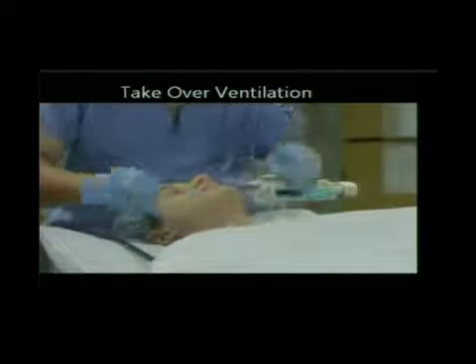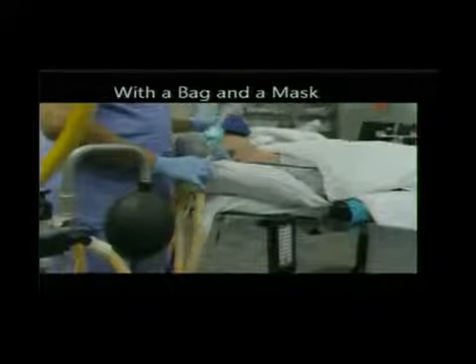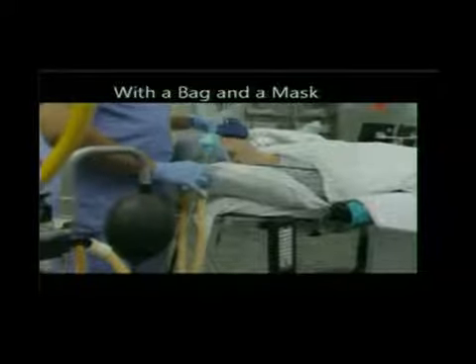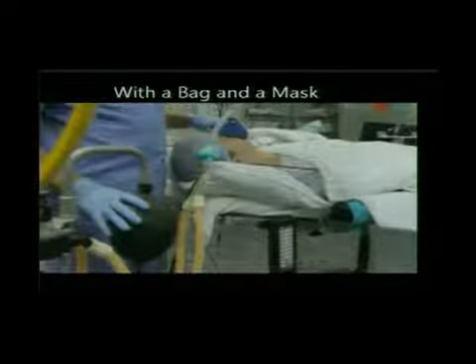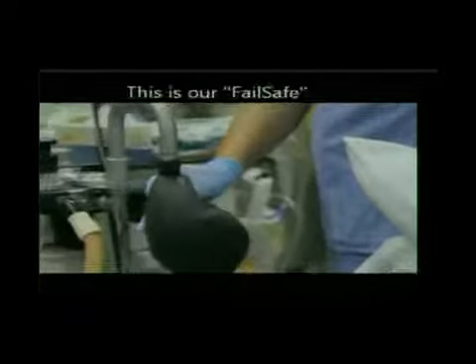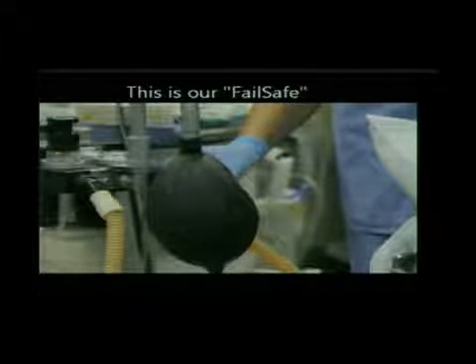So you see no carbon dioxide. He takes off the nasal prongs. Why? He needs to make a seal with the mask, and the tubing interferes with it. So the mask is applied to the face of the patient, the bag is squeezed, and as he squeezes the bag, he forces air into the lungs of the patient. Stop. This is our fail-safe.